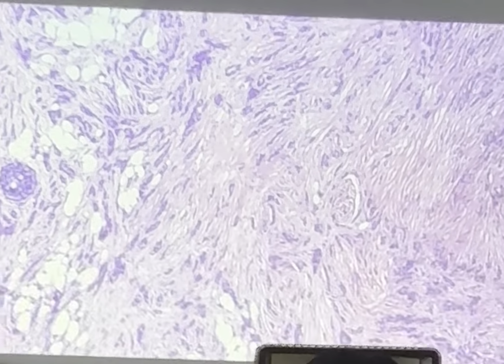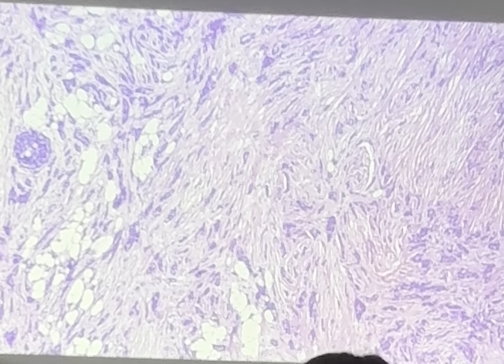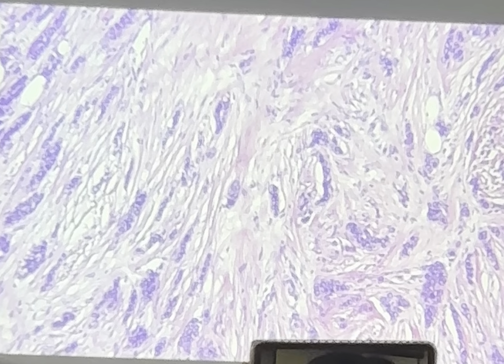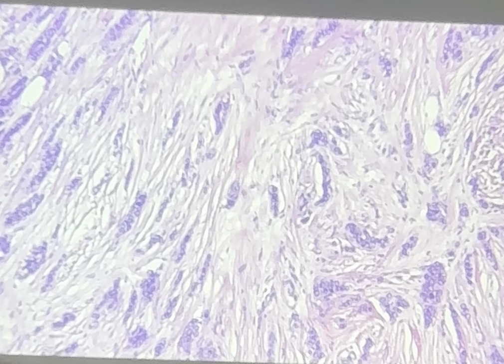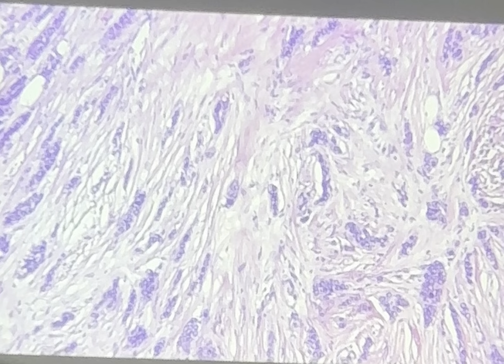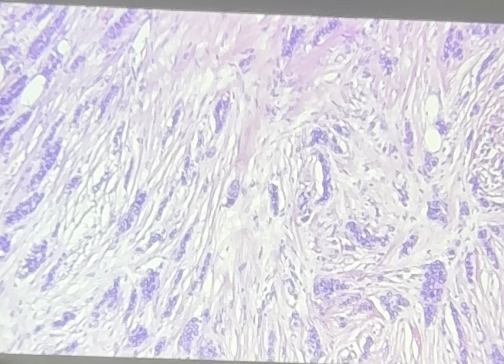This is the diagnosis of this. It's a type of breast cancer. Specifically, well, we'll learn it in more detail. This is called a lobular carcinoma. It's the second most common type of carcinoma. The other one is ductal carcinoma, though nowadays we don't use ductal carcinoma, it's an old term. So we call it mammary carcinoma of no specific type, because technically there are several types of breast cancers, and lobular is one of the subtypes. But the most common is of no specific type.